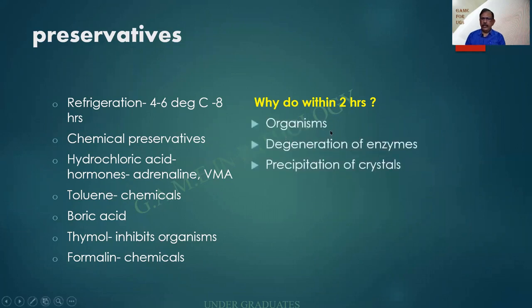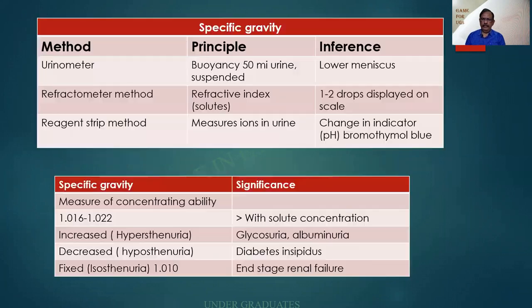Also, there will be the growth of the organisms. The enzymes will become degenerated. So we will have to do it as early as possible. Varley, a superb author in biochemistry, has said the urine is the mirror image of the kidney.